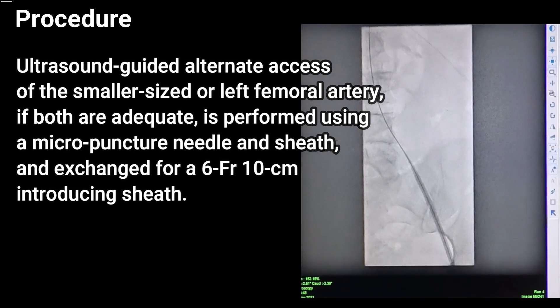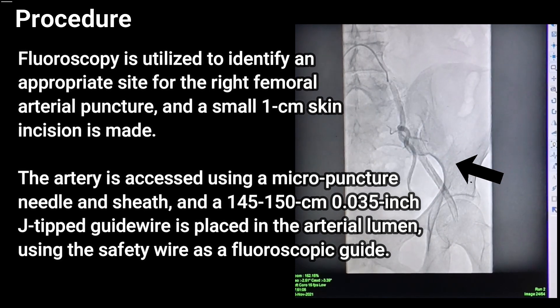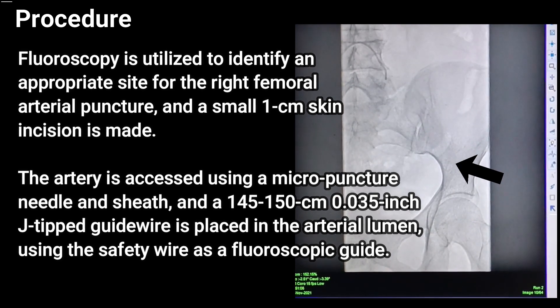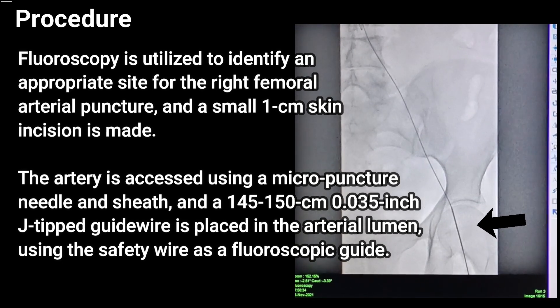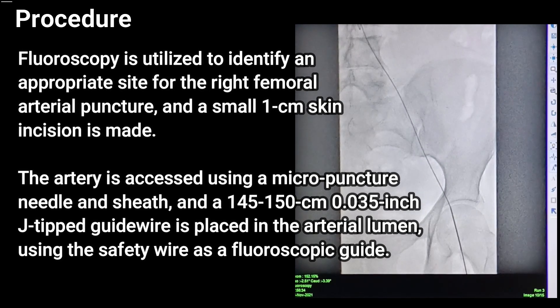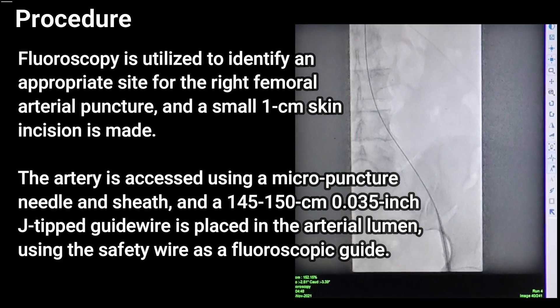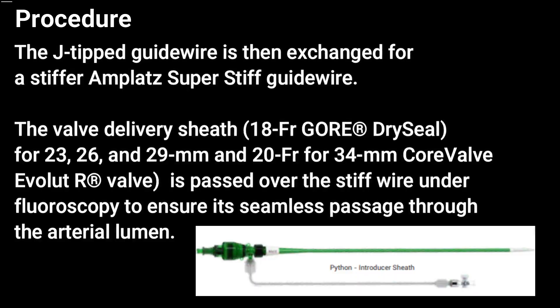Puncturing is performed using a micro-puncture needle and sheath, exchanged for a 6-French 10-centimeter introducing sheath. Fluoroscopy is used to identify an appropriate site for the right femoral arterial puncture, and a small 1-centimeter skin incision is made. The artery is accessed using a micro-puncture needle and sheath, and a J-tipped guide wire is placed in the arterial lumen using the safety wire as a fluoroscopic guide.